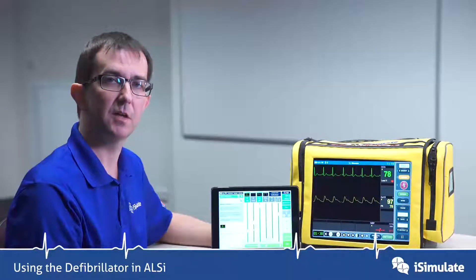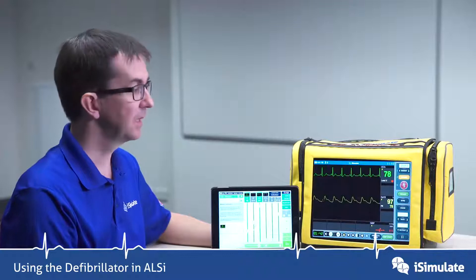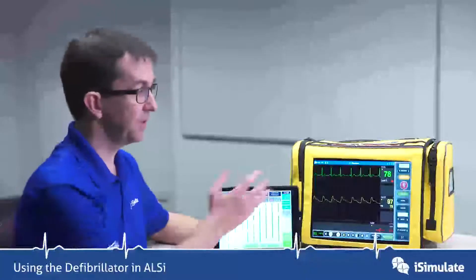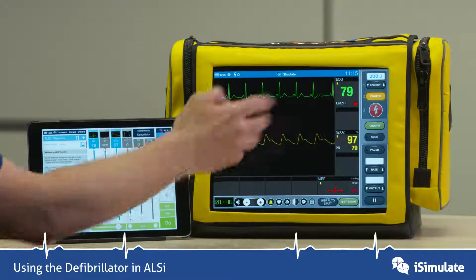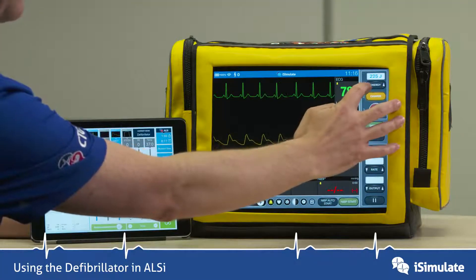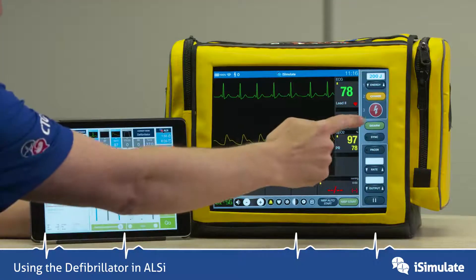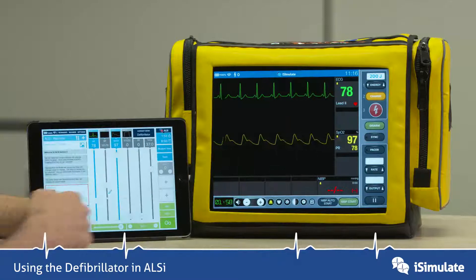Let's have a closer look at the defib functions in ALSI. Looking at the student screen when it's in defib mode, there are a number of controls. You can alter the energy by pressing the up and down buttons. You can press charge and shock, and there's also a disarm button, a sync button, and a pacer function as well.